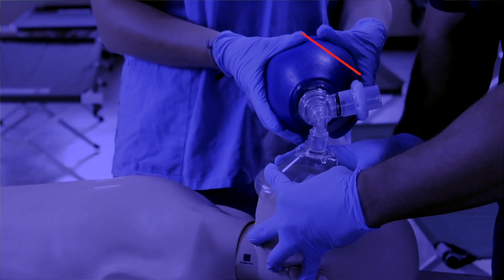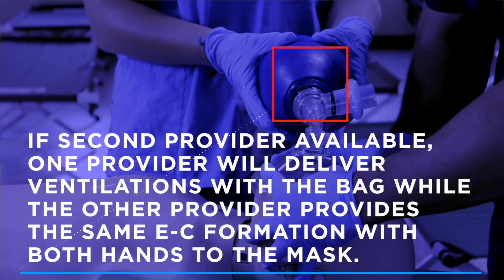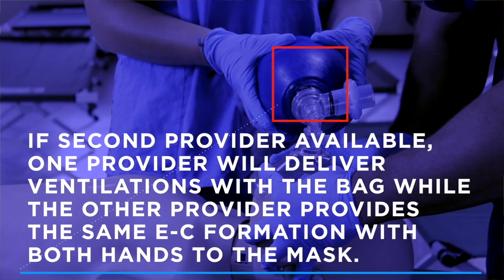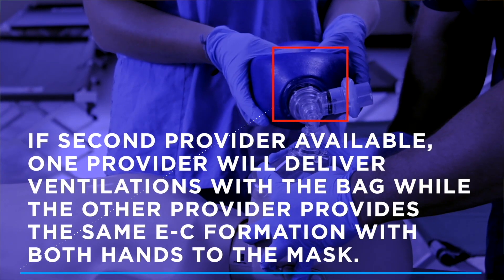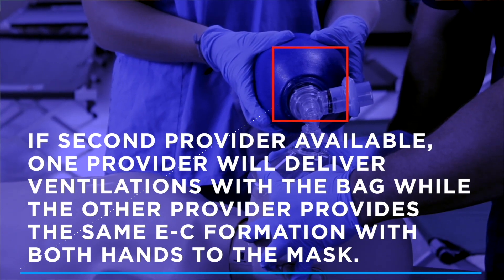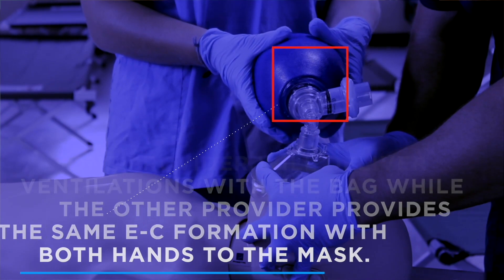If a second provider is available to assist with bag-mask ventilation, one provider will deliver ventilations with the bag-mask while the other provider provides the same EC formation with both hands on the mask.